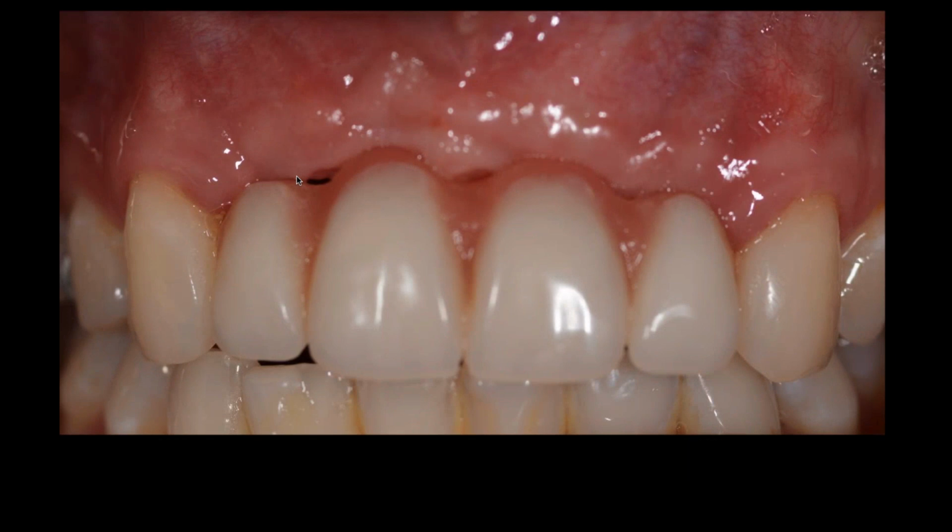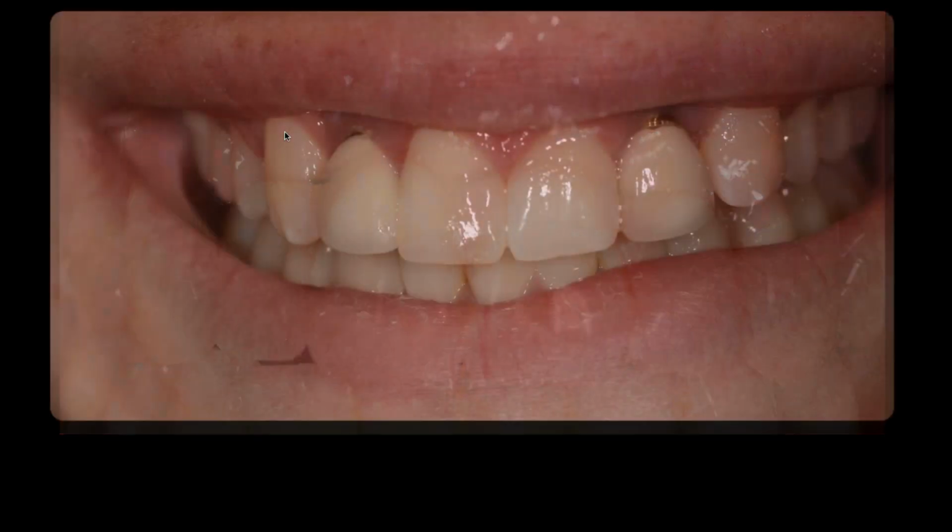Now, when I see this, the first thing I think is, there's a millimeter of red on the gingiva there. Why do you need that? Why don't you take that off, leave the space, and let the gingiva come down, which is what he's in the process of doing now. But this is pretty close. She's getting pretty close to being made a final. I just want to see how she looks without that red on there. She may wear this temporary for 6 months, but that's okay. All the soft tissue underneath that flap will grow just a little bit, but I only need a millimeter, and then we got it going. So, something to say.